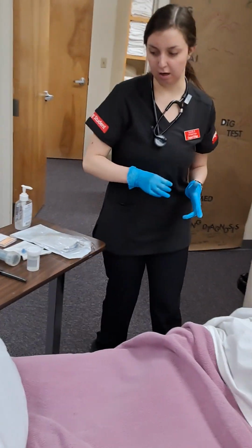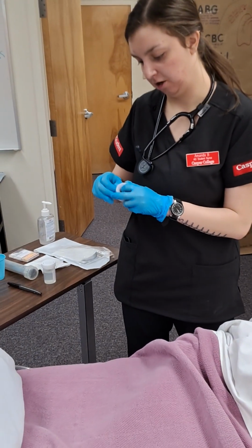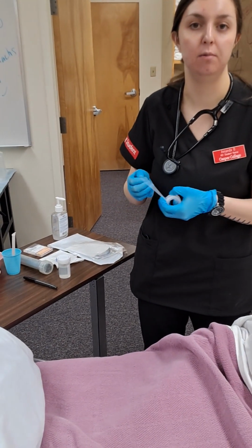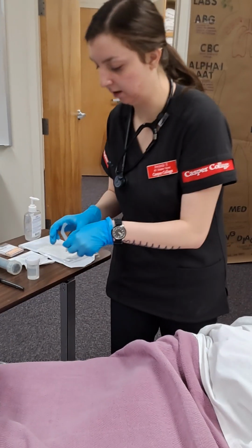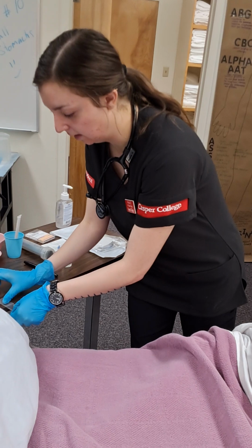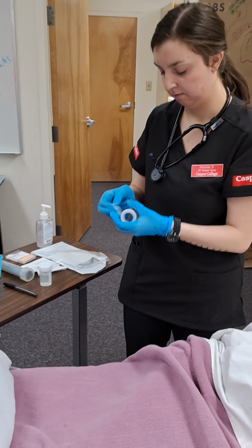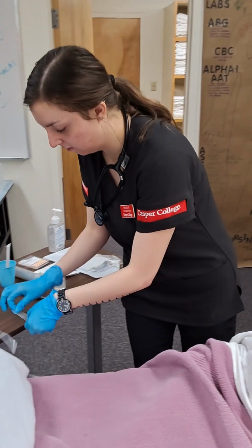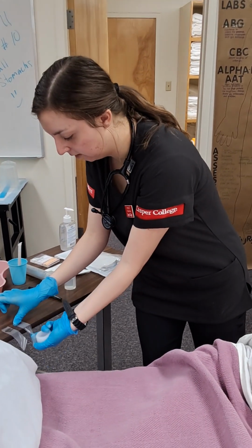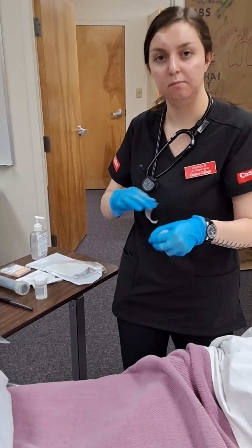I'm going to get my equipment ready. I would use a skin barrier wipe before I put on this tape, but we don't have that, so I will just verbalize that that is what I would do. I'd also use a fixation device, but we don't have that, so I will just be using the tape.